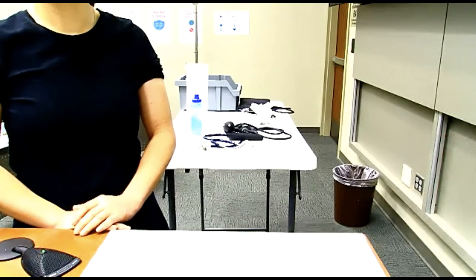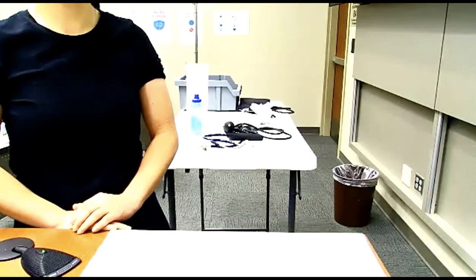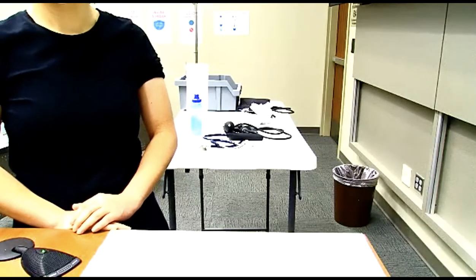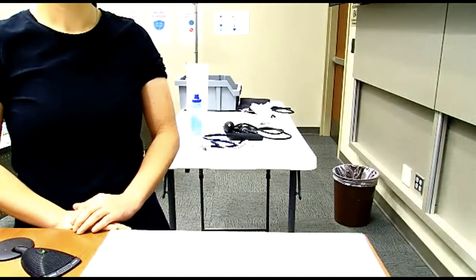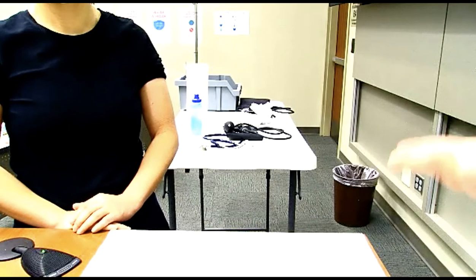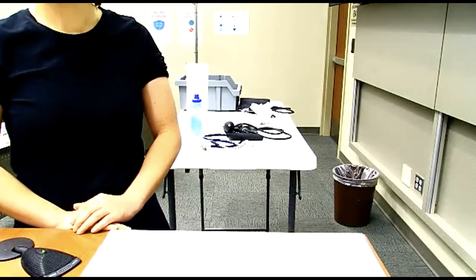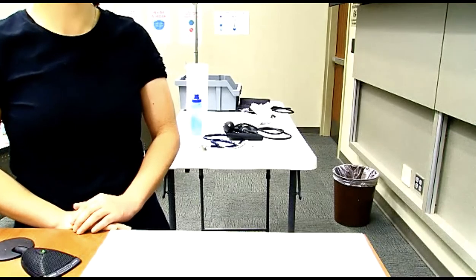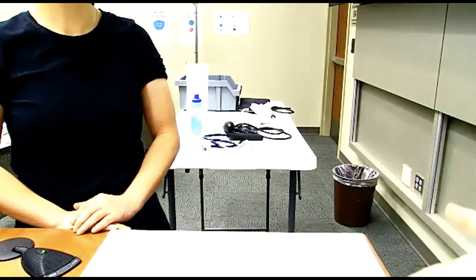So let me ask you, have you taken any medications today? No. Okay. Have you consumed any caffeine? No, I don't drink coffee. Okay, no coffee, no caffeine. Have you used any tobacco or nicotine-containing products? I don't smoke either. How about exercise? I've been sitting around more than 2 minutes. Okay. And lastly, can you tell me what your blood pressure normally runs? Usually running at 100 over 70. 100 over 70. All right. There you have it. That's step one. You didn't even have to do anything.